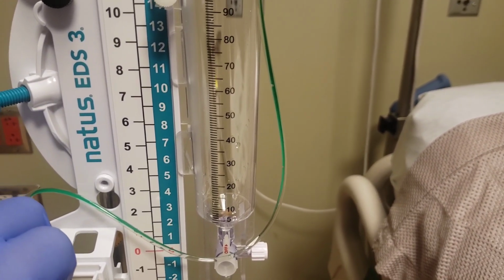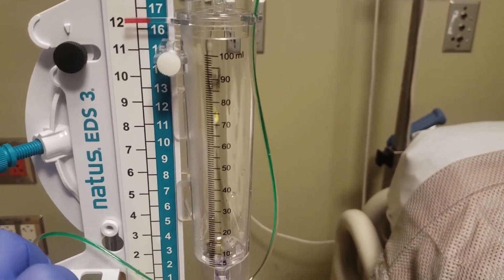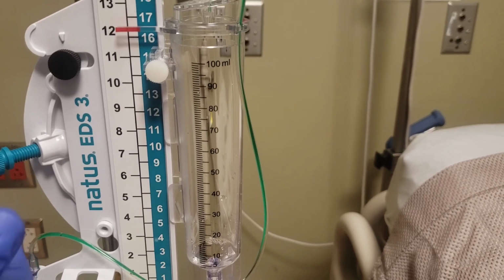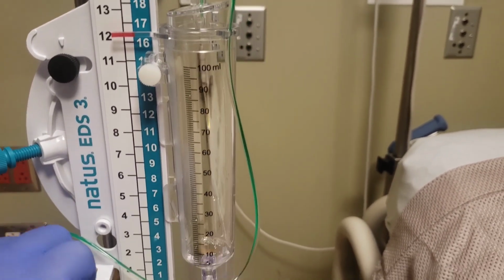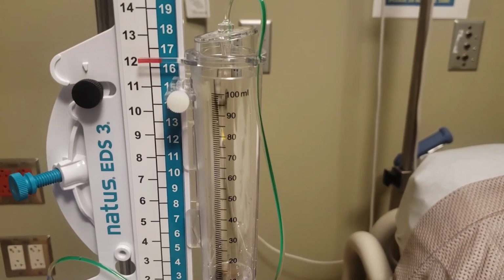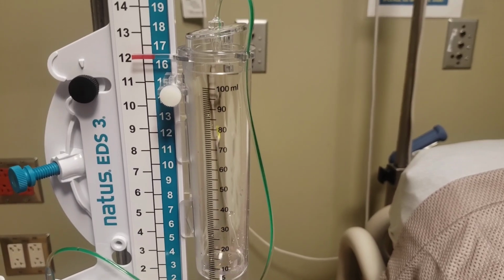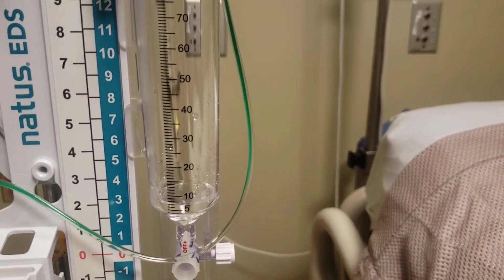Now, what you have to pay attention to is how quick. If it's shooting out like this, you really need to clamp your drain immediately so that not too much drains out at once, because we don't want that. But if you have a nice, slow, steady drip, watch it until you get to the prescribed amount of drainage set by your physician. In this case, we're going to just let it drain to about here.